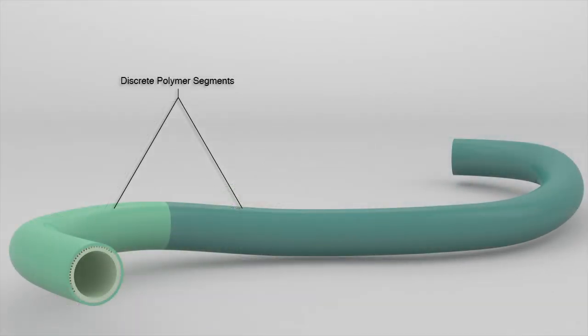In many conventional guide catheters, the outer layer consists of discrete polymer segments for variable flexibility along the length. These conventional shafts are often assembled manually from multiple components.